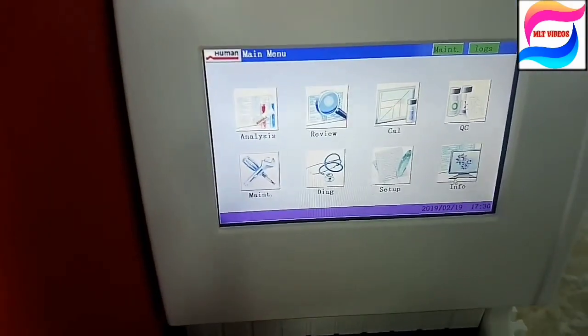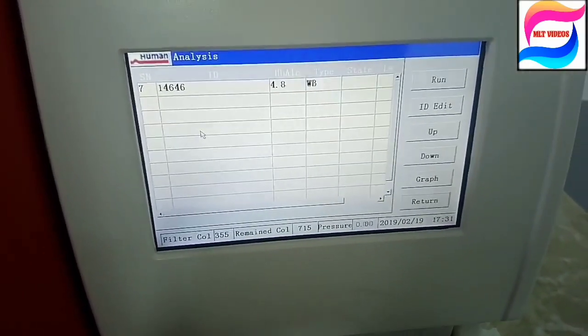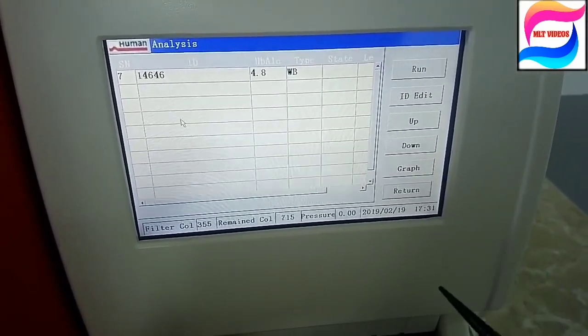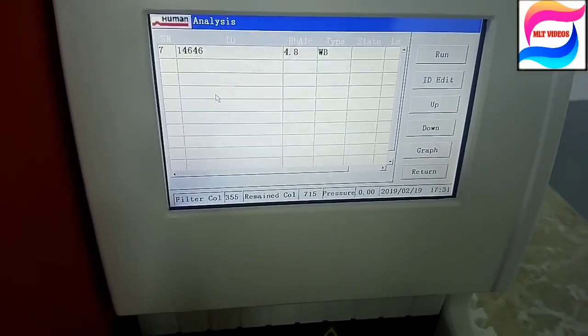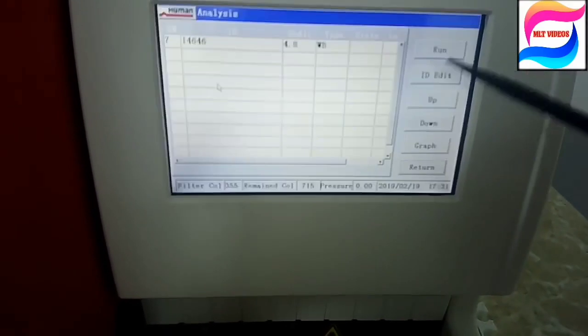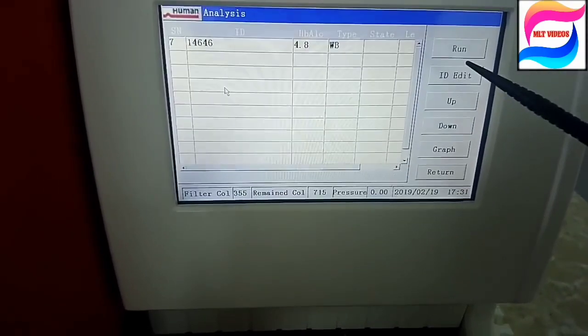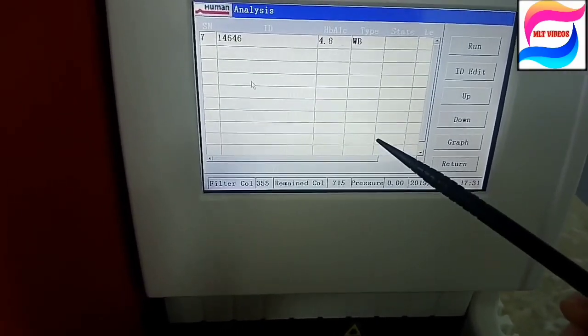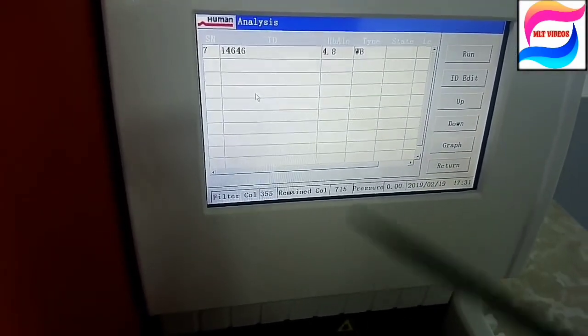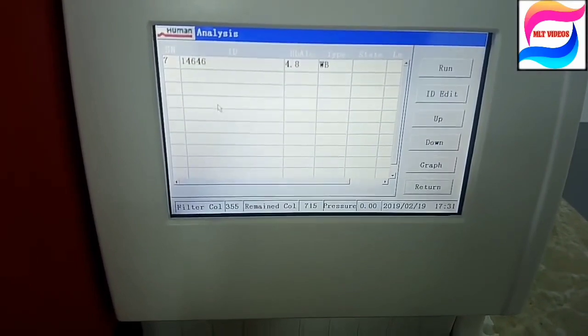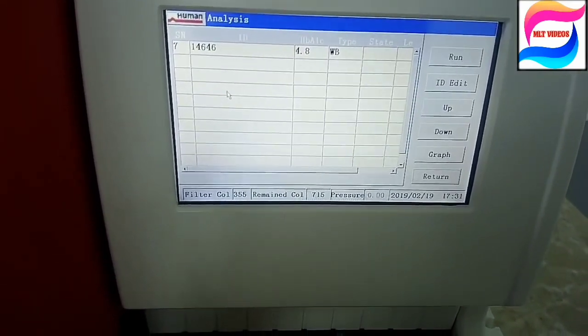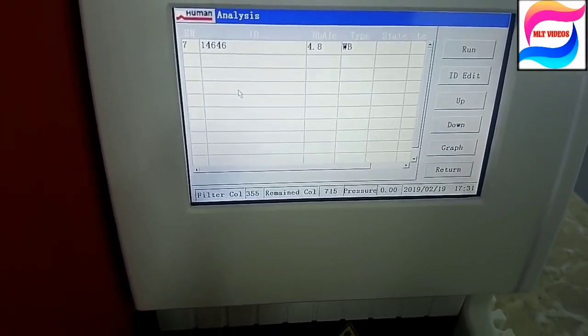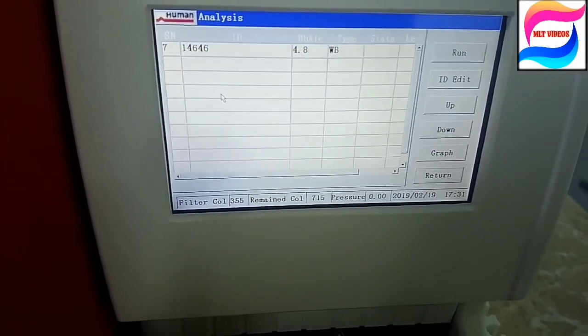So first of all, what are the sections in this machine? Analysis, Review, Calibration, QC, Maintenance. First is Analysis. In Analysis we will program the test. We can see how many filters, column pressure, everything we will see in Analysis. In ID Edit we will go and we will add the sample and we can run. That will be in Analysis section. Analysis means we will analyze the sample.